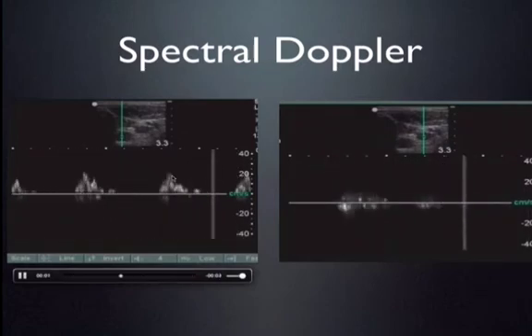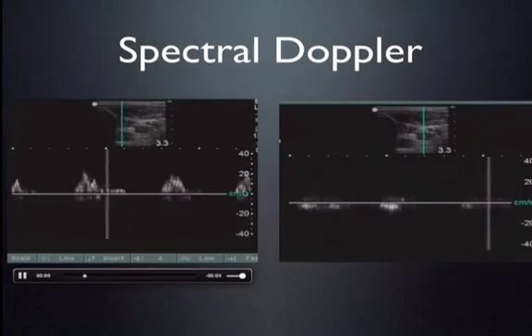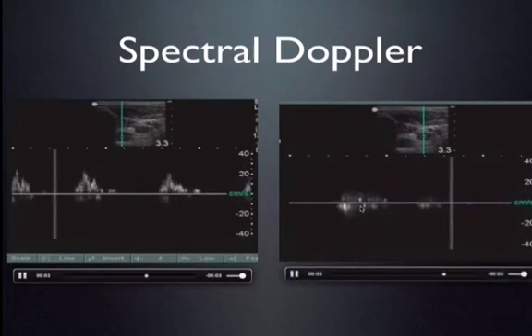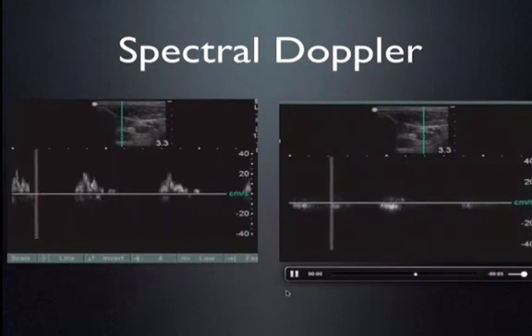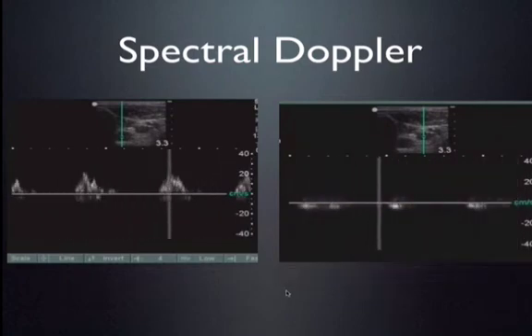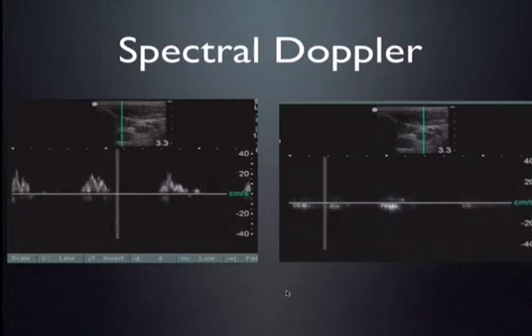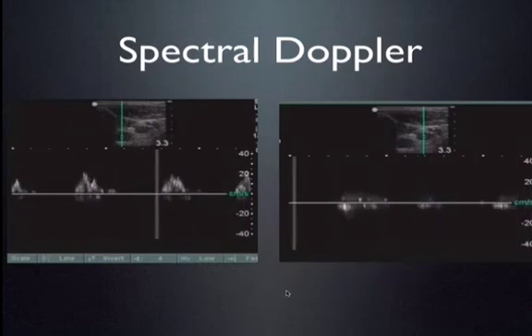So you can see right here, in this case, the blood flow is moving approximately 20 centimeters per second, and in this instance, here, blood flow is kind of undulating around 5 centimeters per second. And this would be another indicator of arterial versus venous flow, but again, that also has pitfalls.